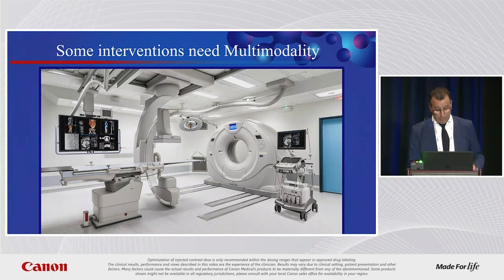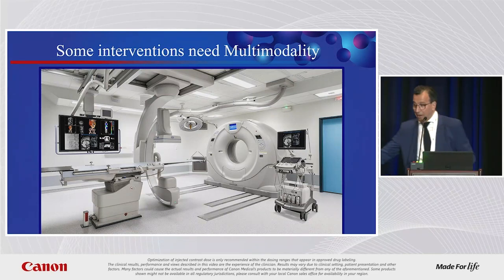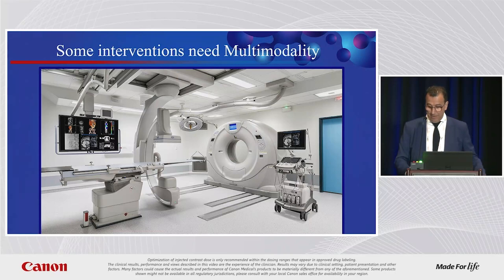If you look at the workflow in the room, it's very easy. You can begin like here, with the angio part. That's why in the majority of cases when we are doing liver or kidney today, nearly every central tumor, every difficult tumor, we begin with the positioning of a catheter. It's taking 10 to 15 minutes. I'm sure for Dr. Ara even less. I have seen him working in 10 minutes in and out.